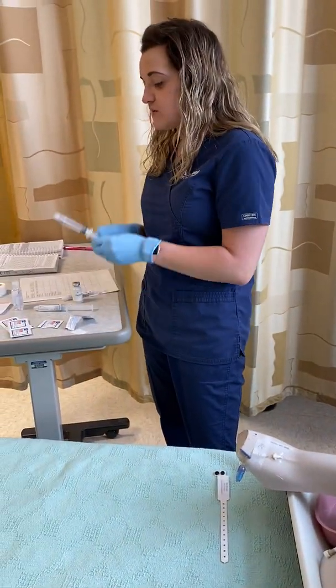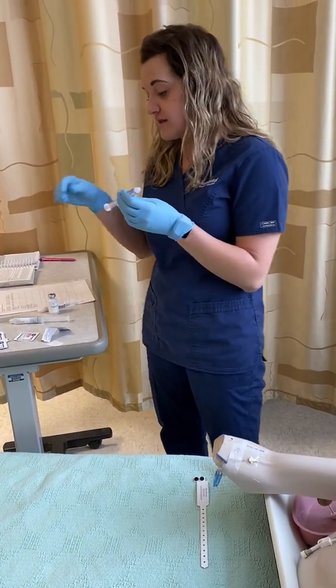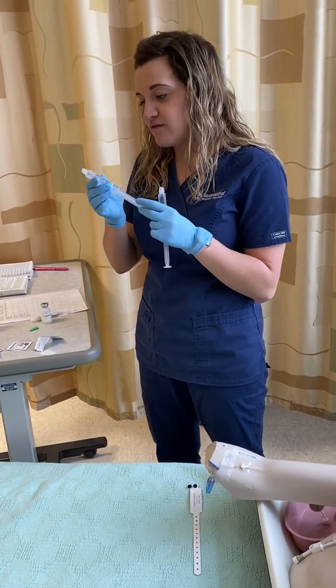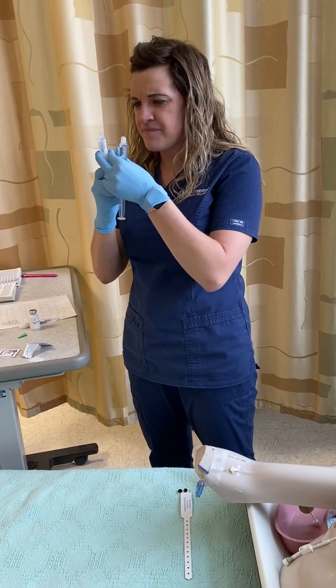First thing I'm going to do is just check the expiration date on my saline flushes. They are not expired, so we can go ahead and give those. First thing I'm going to do is just remove the air.